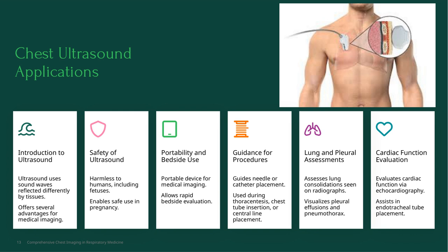Ultrasound guidance is also invaluable during procedures like thoracentesis, chest tube insertion, or central line placement. It helps us be precise and safe, reducing complications. Another major advantage is portability.